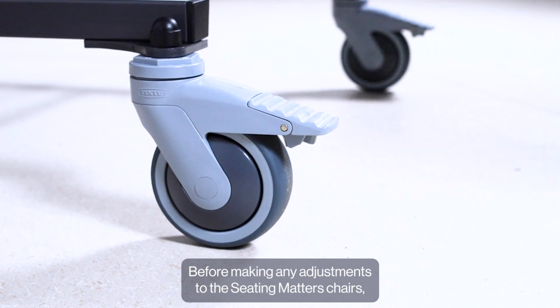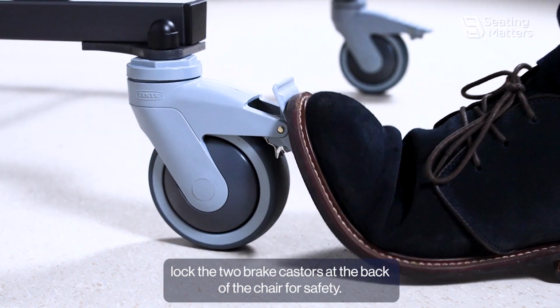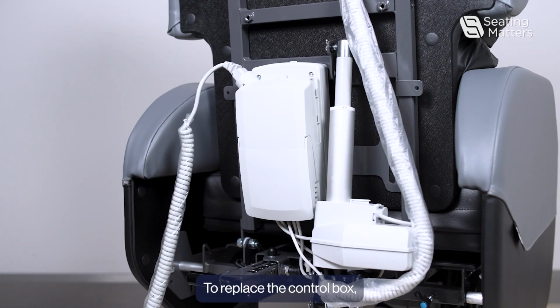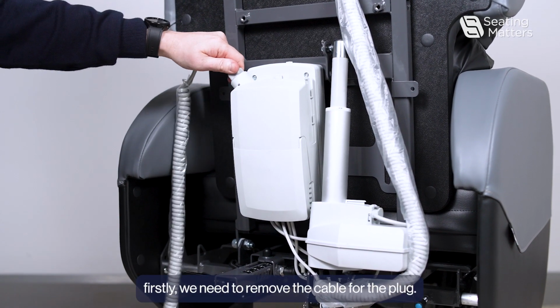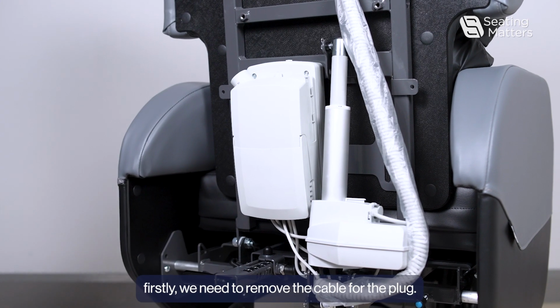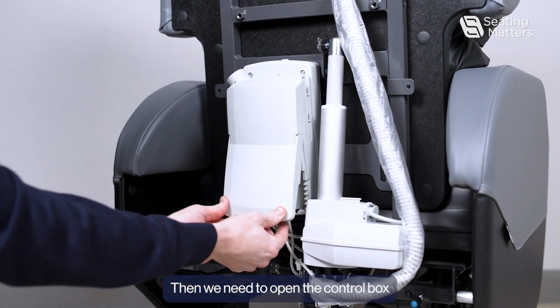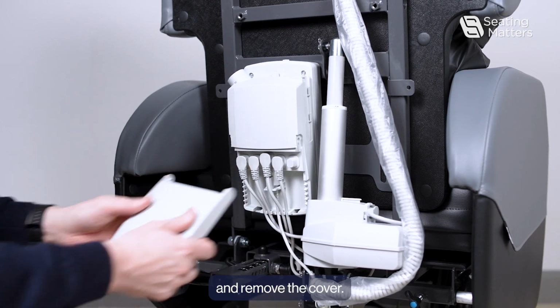Before making any adjustments to the Seating Matters chairs, lock the 2 brake casters at the back of the chair for safety. To replace the control box, firstly we need to remove the cable for the plug. Then we need to open the control box and remove the cover.